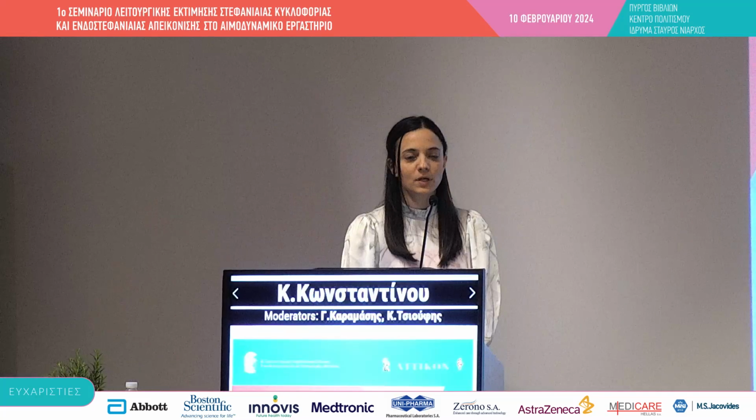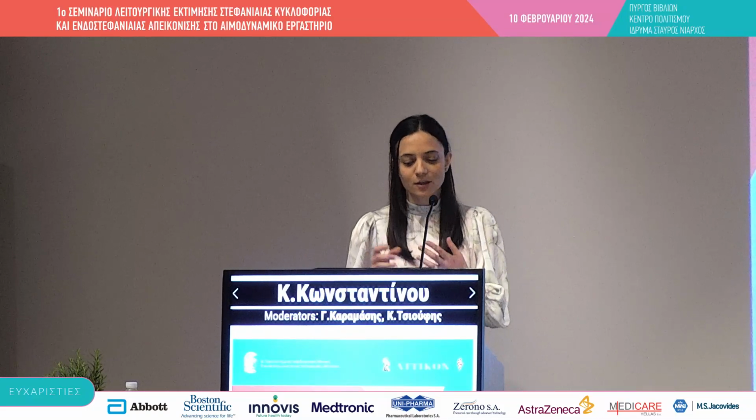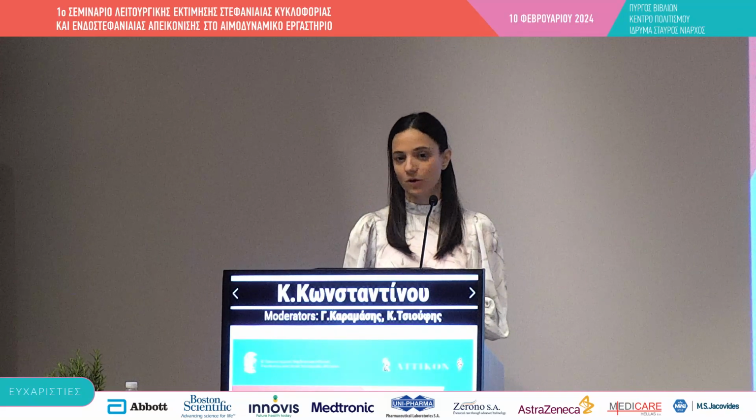Thank you. Do you mean that you get epicardial spasm? We've all seen it during angiograms or PCIs, haven't we? Yeah. Well, I think if you see spontaneous spasm, it is very likely that they would get spasm with acetylcholine, if they can get it spontaneously or with manipulation, the coronary engagement of the guide or putting a wire down.